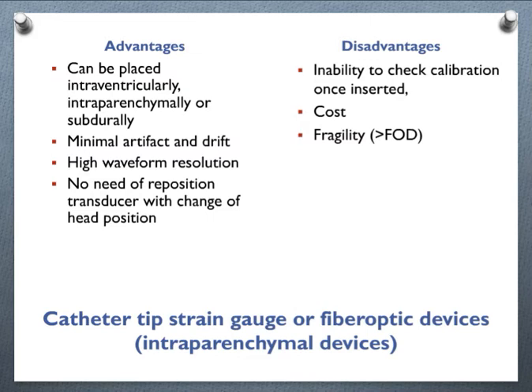We are used to analyzing 150 samples a second, for example, for obtaining the pressure, the PVI, the index of autoregulation. We have a very good resolution with this kind of device. You have to consider that we have a higher cost, and at this stage we have to consider the cost closely, and for the fiber optic device we also have the fragility of the system.